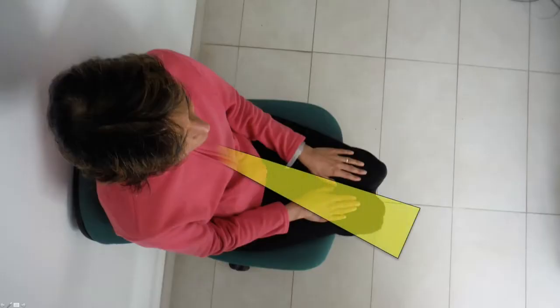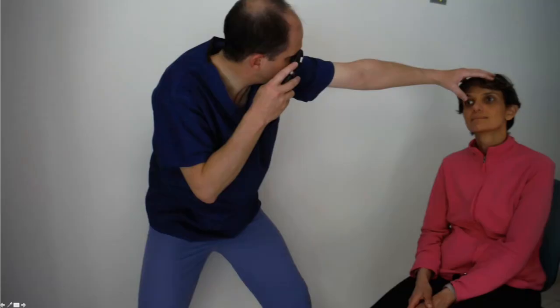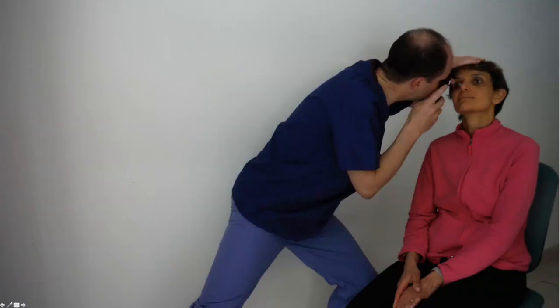Seen from on top, you can see that your flight path needs to take you down a narrow cone straight onto the patient's eye and not veer off to any other part of the head. So your movement in effect is a bit like a lunge from arm's length from the patient right up to very close to the patient.